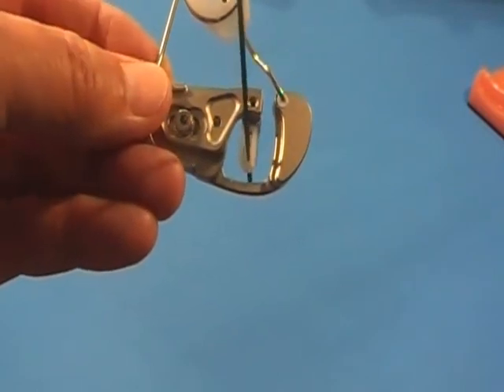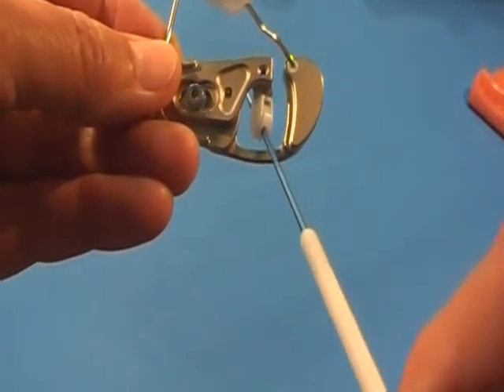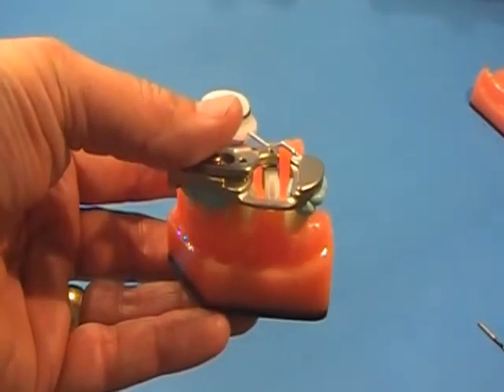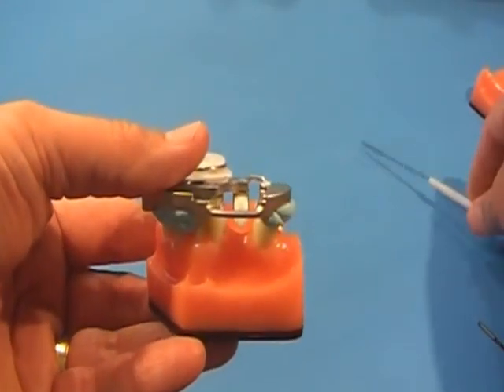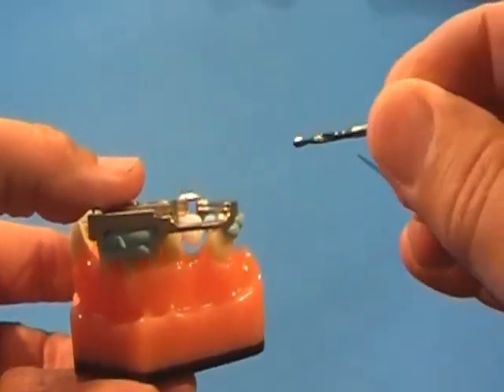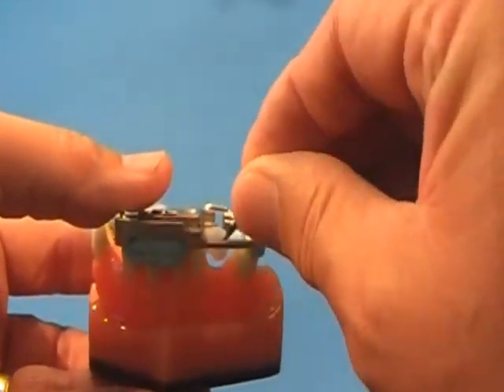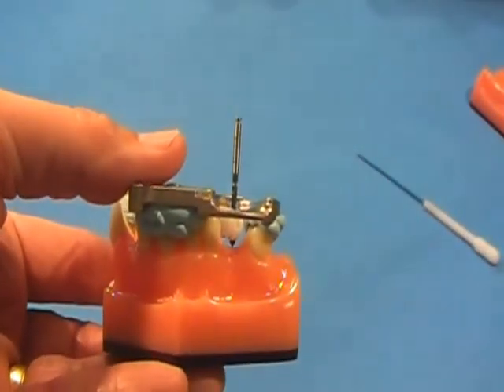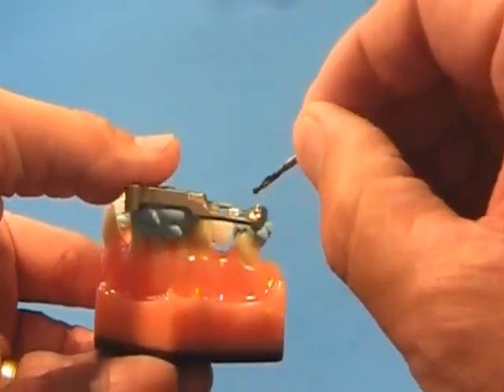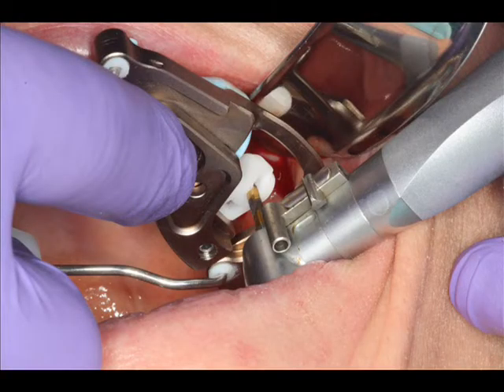The bushing that holds your drill bit is also movable in all three planes of space, and the guide can be cone beam imaged. The surgical field is an open view field, and the bushing is a side loading bushing. So even in posterior areas, you can easily get your drill bit in and out of your patient's mouth.